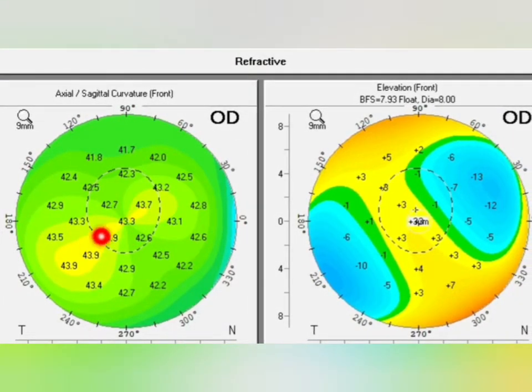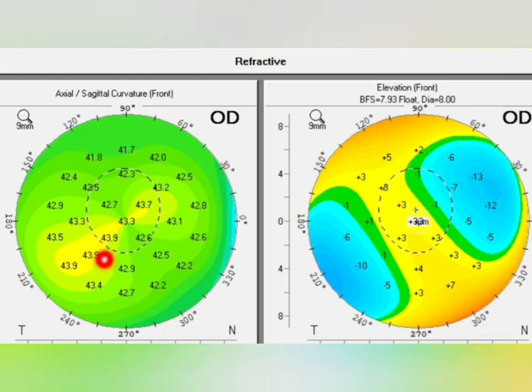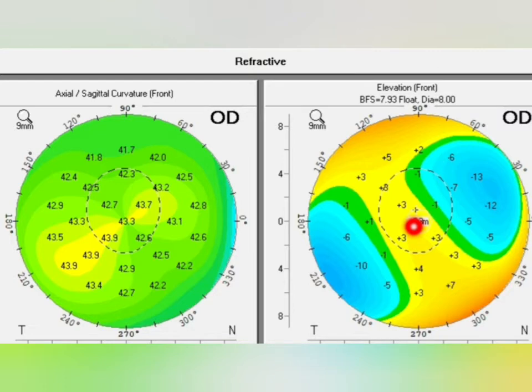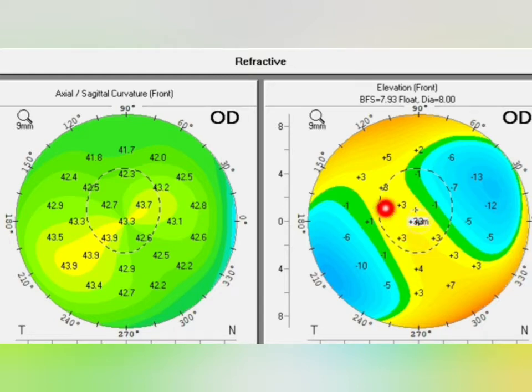The anterior sagittal curvature shows asymmetrical bow tie with inferior steepening and oblique astigmatism. If you calculate the difference between two opposite corresponding points — 43.9 and 43.2 — it is less than 2.5, so it is absolutely normal. Moving to elevation front, the thinnest local point is plus 3, which should be less than 8, so it is normal. The central 3mm area is less than plus 18, also normal.